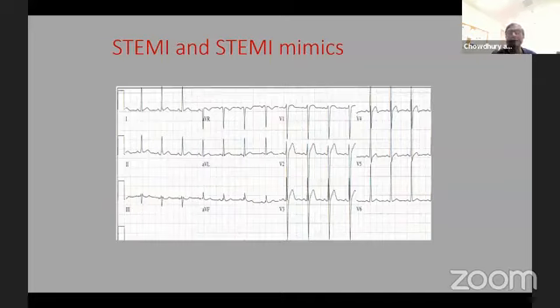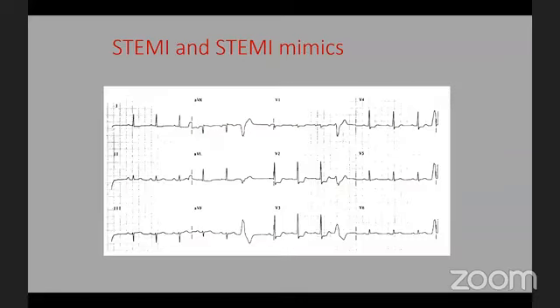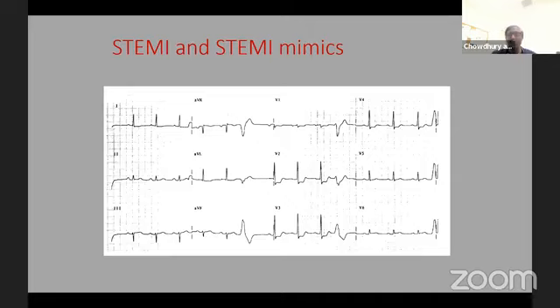The patient also had hypercalcemia. Yes. So hypocalcemia and hypomagnesemia can give you long QT, but hypercalcemia can give short QT, usually if corrected, less than 360. What about this one?